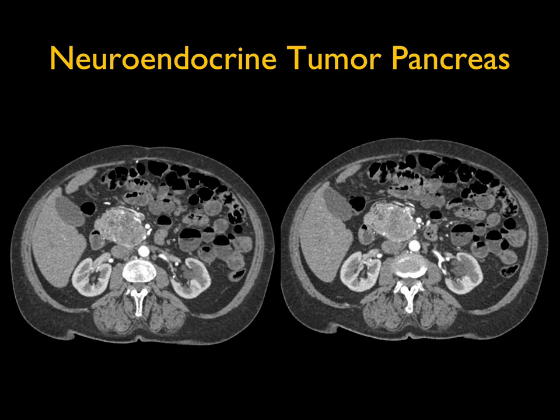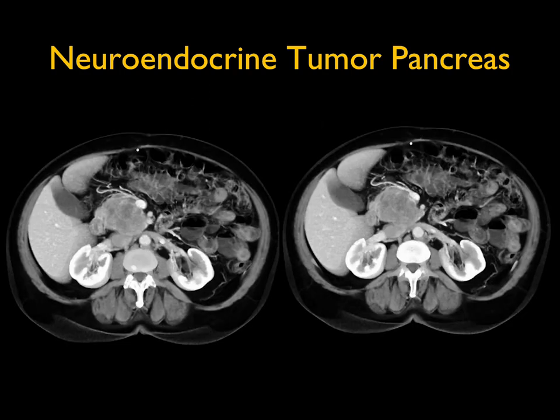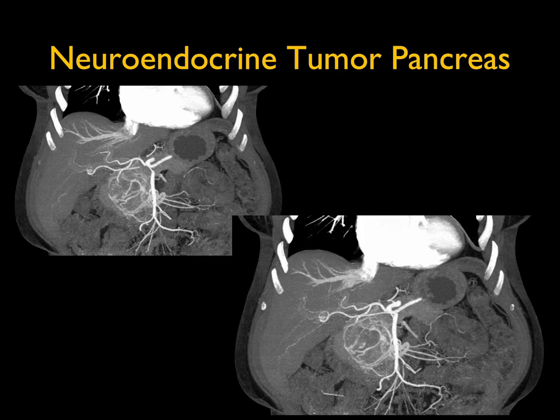Case six: a solid lesion in the head of the pancreas with vascularity. There's no dilated duct — it's solid with some increased vascularity. That changes your differential from adenocarcinoma, which is the first thing we think about in pancreatic masses, to a neuroendocrine tumor. Neuroendocrine tumors can be very vascular or mildly vascular, or at times hypovascular. They can be focal at one centimeter or larger, and can stretch or invade vessels. The celiac and SMA appear patent but there's increased vascularity.